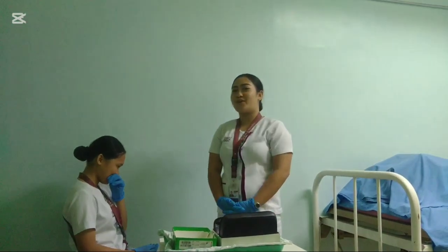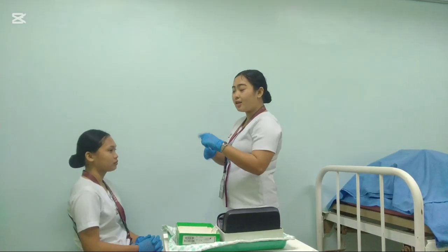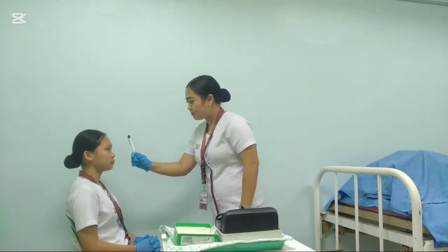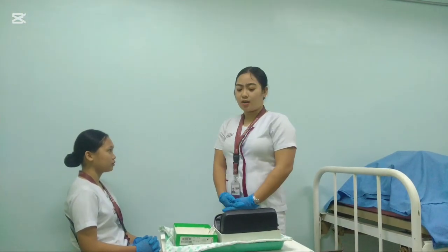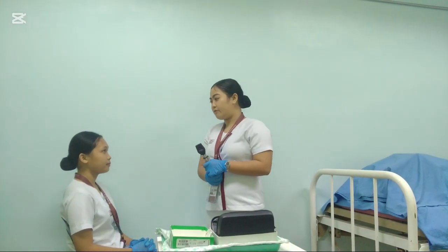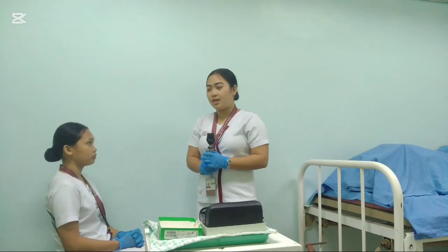Next is to test for pupillary accommodation and convergence by asking the patient to focus on the object as I bring it closer to the nose. Okay, Miss, can you focus on the object and do not move your head? Okay, so the patient's pupils are equal, round, reactive to light, and accommodation. Next, using an ophthalmoscope, I will check for the patient's red reflex to see if she has any diseases such as glaucoma or cataracts.